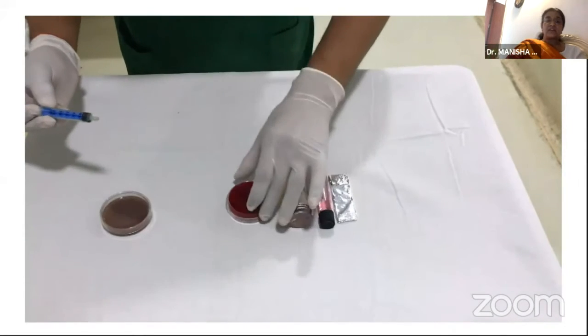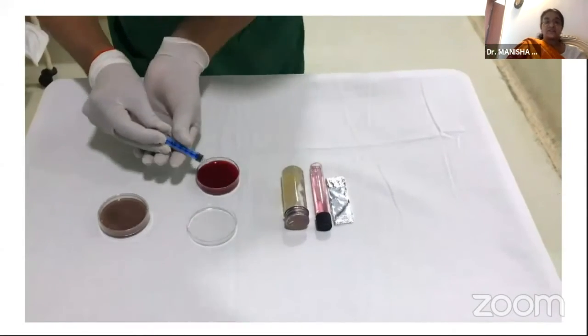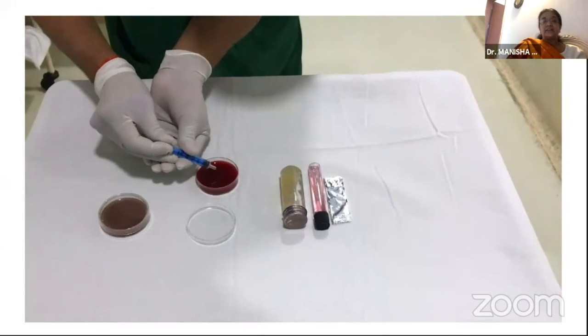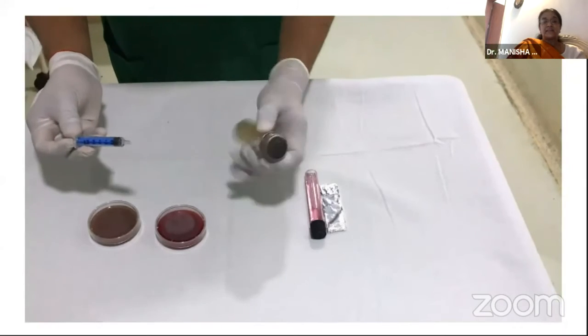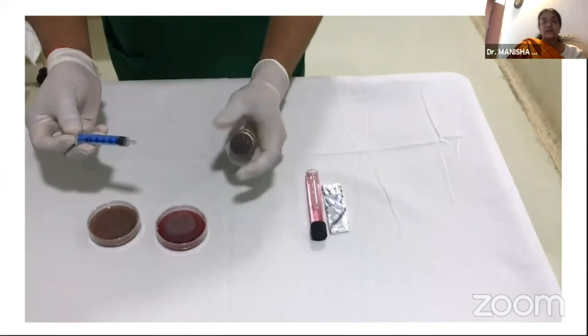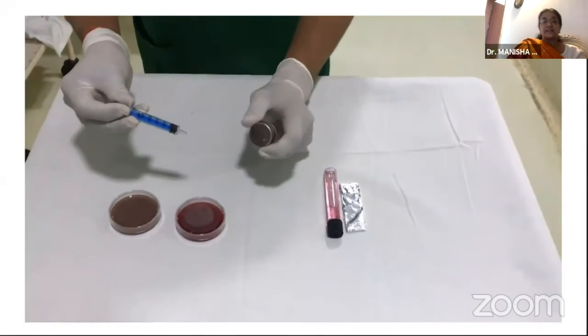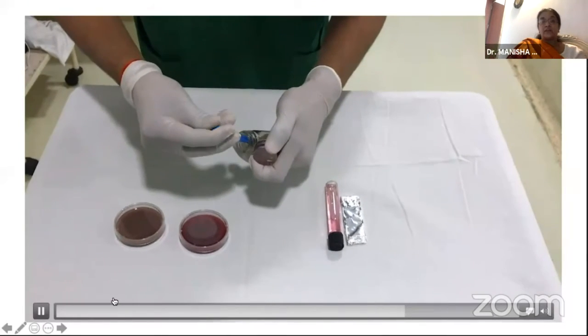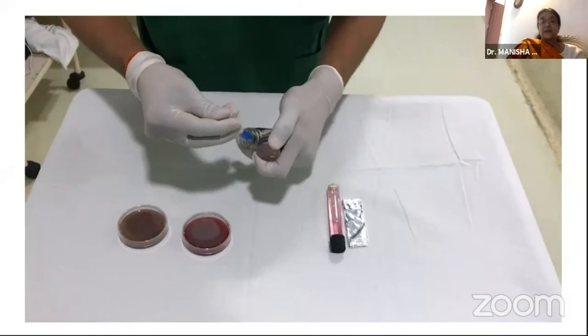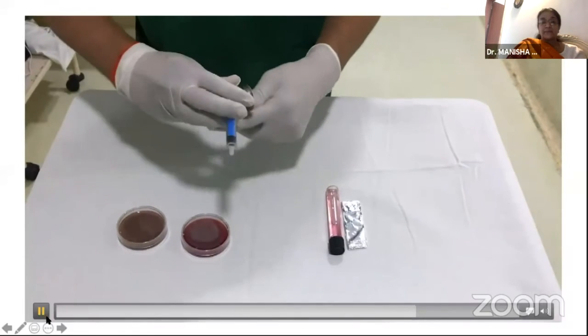It's always a good idea, if you can arrange, to inoculate the sample in the operation theater itself. So you see all the culture plates and the various medias. You are having it in the operation theater, and I think this is the best way of inoculating your sample, which would avoid the least of the contamination to your sample.